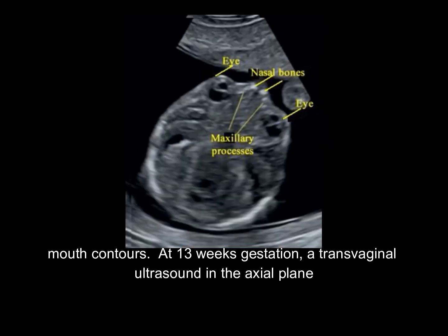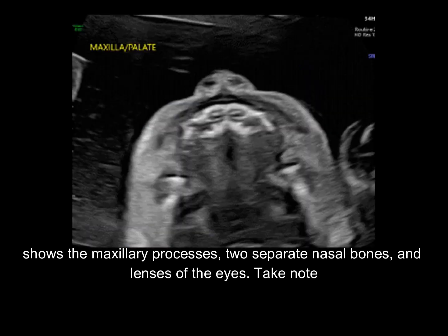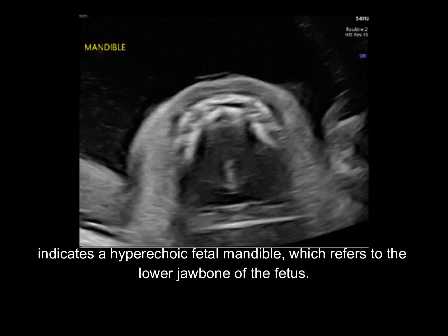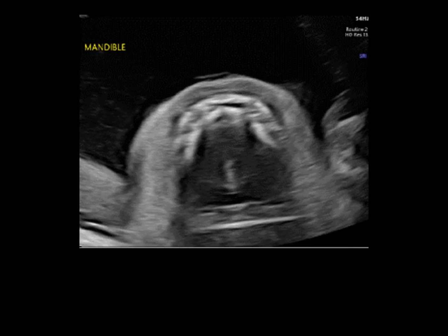At 13 weeks gestation, a transvaginal ultrasound in the axial plane shows the maxillary processes, two separate nasal bones, and lenses of the eyes. Take note of the bright area on the image indicating a hyperechoic palate or maxilla. This ultrasound indicates a hyperechoic fetal mandible, which refers to the lower jawbone of the fetus.